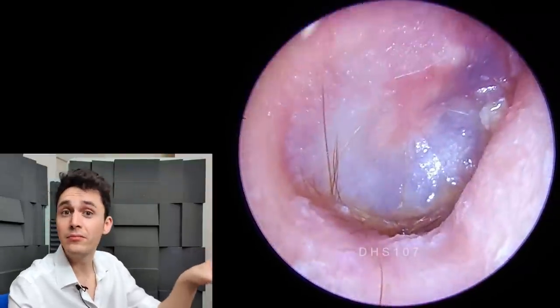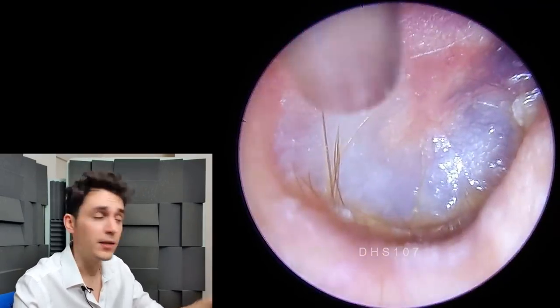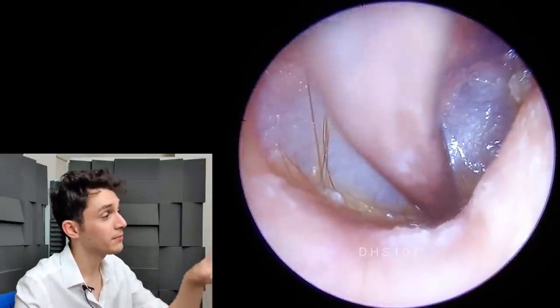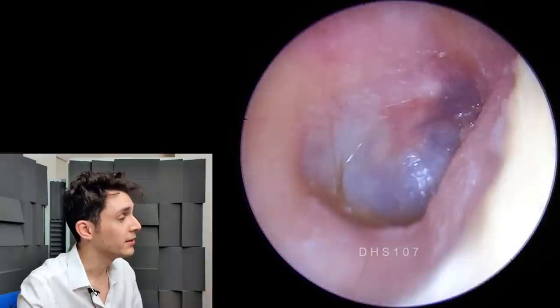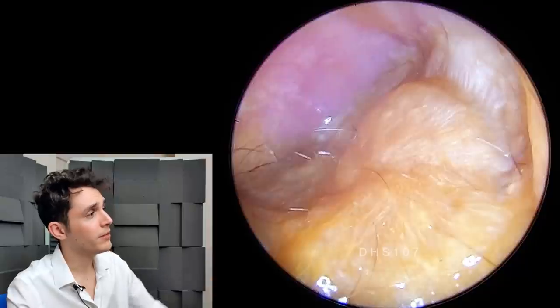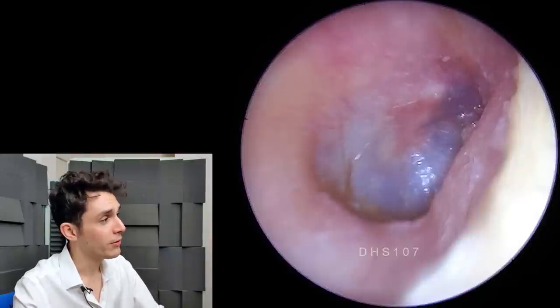The patient at this point had had enough, which is absolutely fine. We're being pernickety at this point — we are working very close to the drum and the drum is clear. The ear is clear of 99% of wax, so the hearing has come back to normal. The problem with working this close to the drum is that it is very excessively loud for the patient, so we don't like to linger too long. But there's the finished product — a lovely clear ear. There's the before, obviously just a complete swamp, a complete mess, resulting in a mild to moderate hearing loss. End product: a very nice procedure.